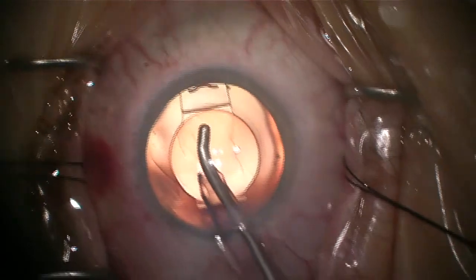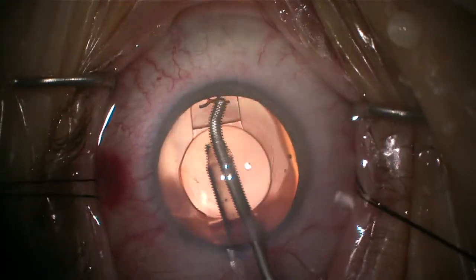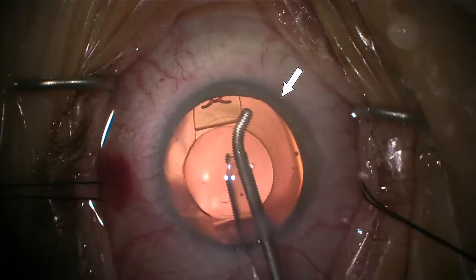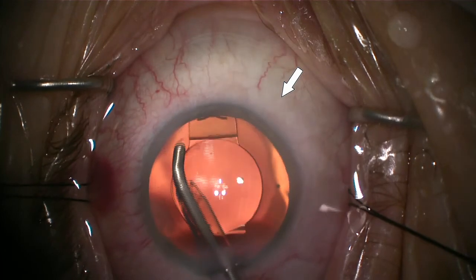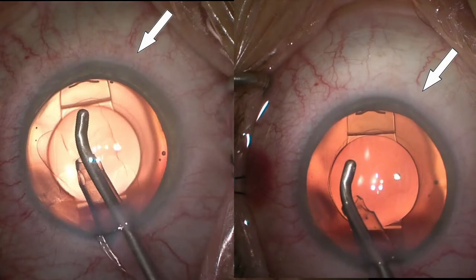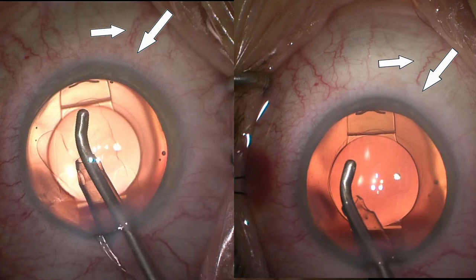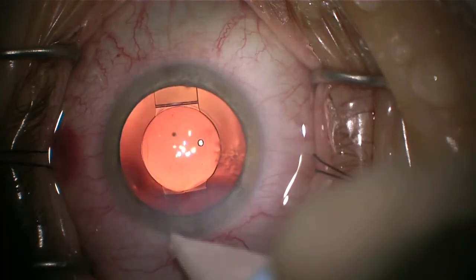Now I'm going to remove viscoelastic like any other cataract surgery. What I love seeing is the blanching you see while removing viscoelastic — you can see here in slow motion how the blanching of the episcleral perilimbal vessels occurs. If you look at it still on the left just before doing I&A, you see in that blood vessel there, the smaller vessel is now blanched and gone by removing I&A and removing viscoelastic.